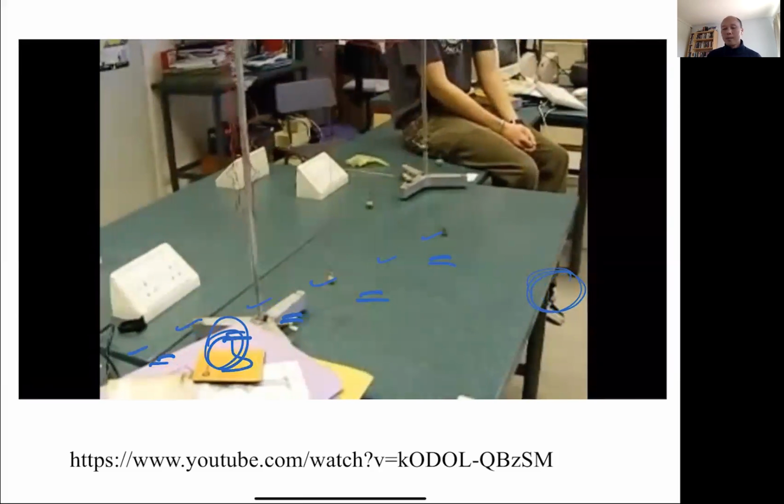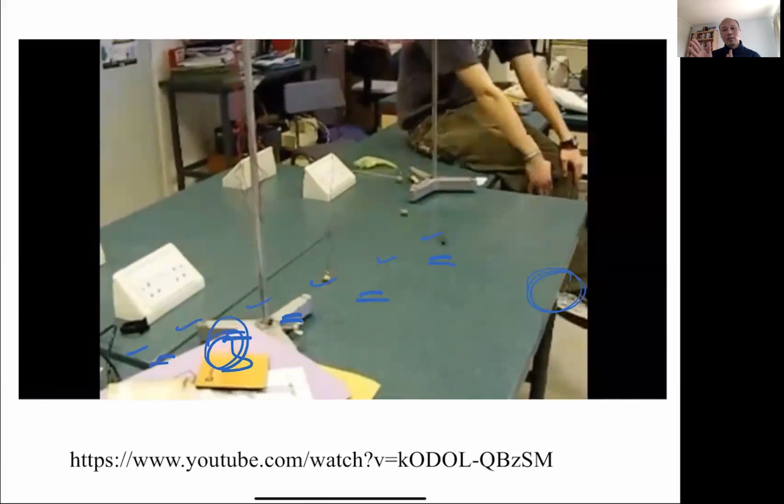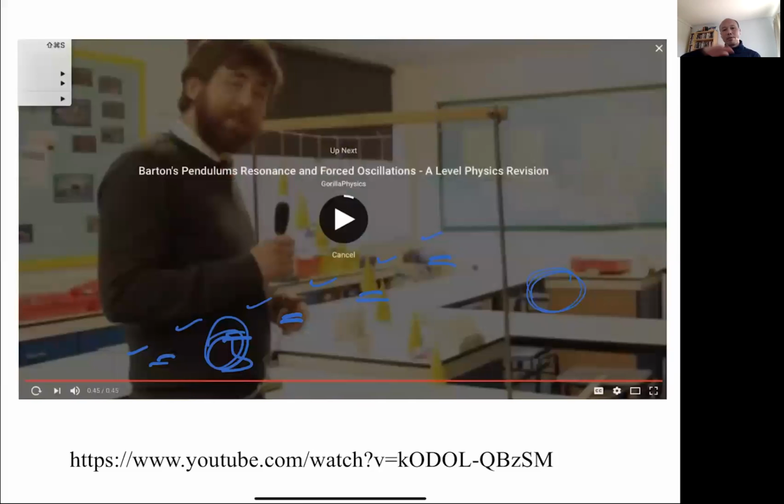So basically, the RF pulse, the driving mechanism, has some frequency. And the different lengths of those strings is similar to what we have with an MR gradient, where each ball has its own frequency. If we excite in the presence of that gradient, then we can isolate one of those pendulums to excite. Okay, so we'll pick up again on that next Monday.